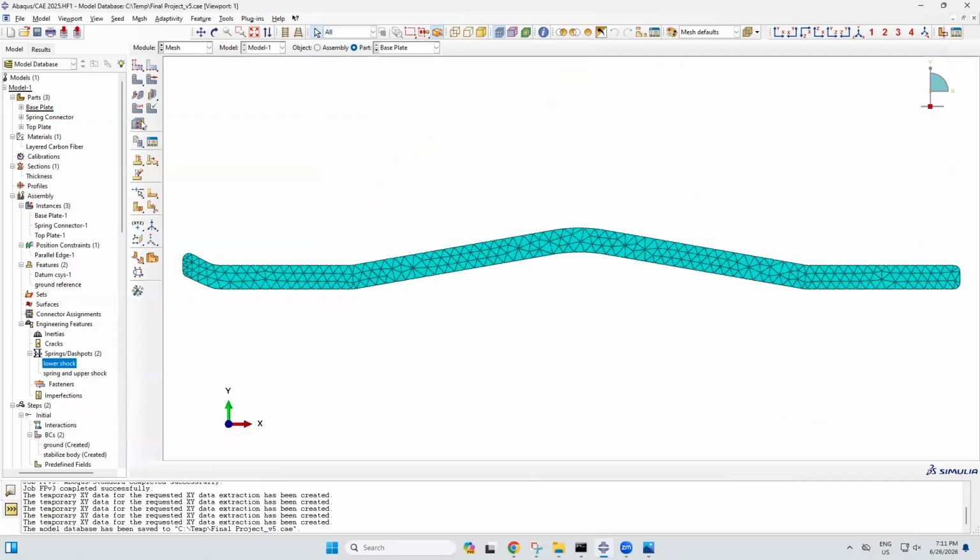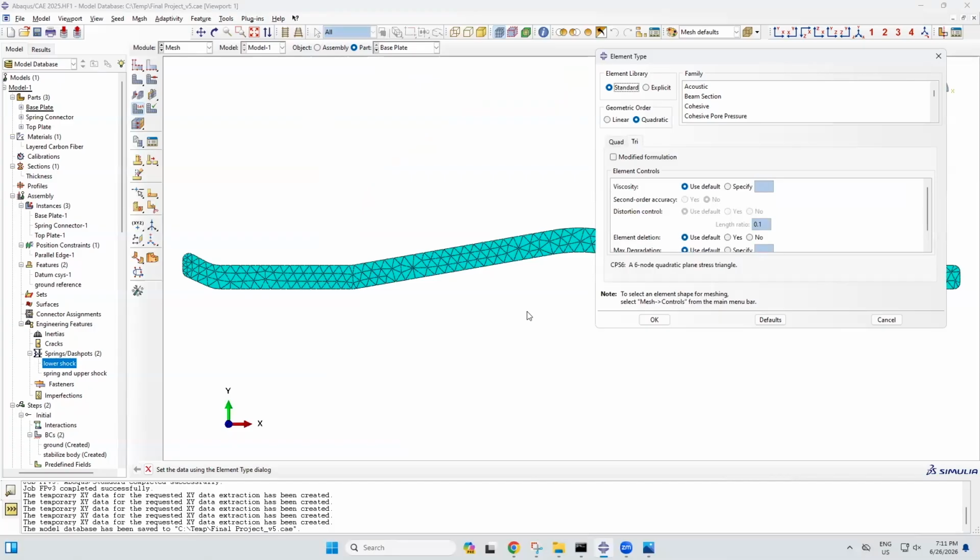The last element type I used was CPS6 or quadratic triangular elements. These are also very deformable, similar to the top plate. However, the top plate was having trouble with some nodes, so it could only handle the CPS4 instead of the CPS6. These elements, just like the spring connector, are triangular.